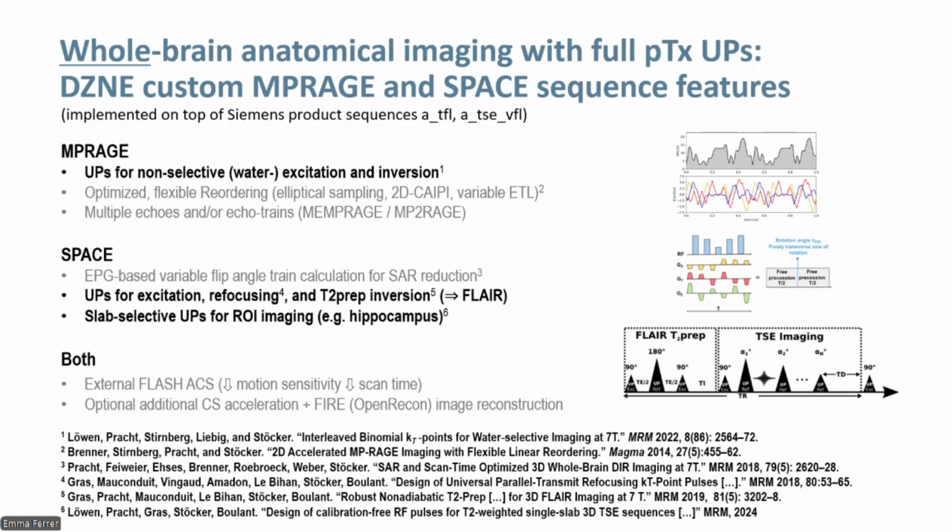Both of them share features like external FLASH autocalibration scans to reduce motion sensitivity and also to cut down scan time. And optionally, they can also perform compressed sensing sampling and online image reconstruction.